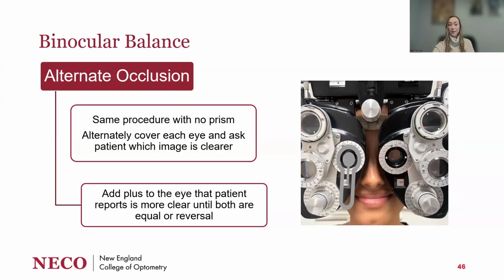So be very clear on the language you use. Make sure you are aware whether you're asking them which one looks more clear or which one looks more blurry, because that's going to determine whether you add plus to the right or the left eye.